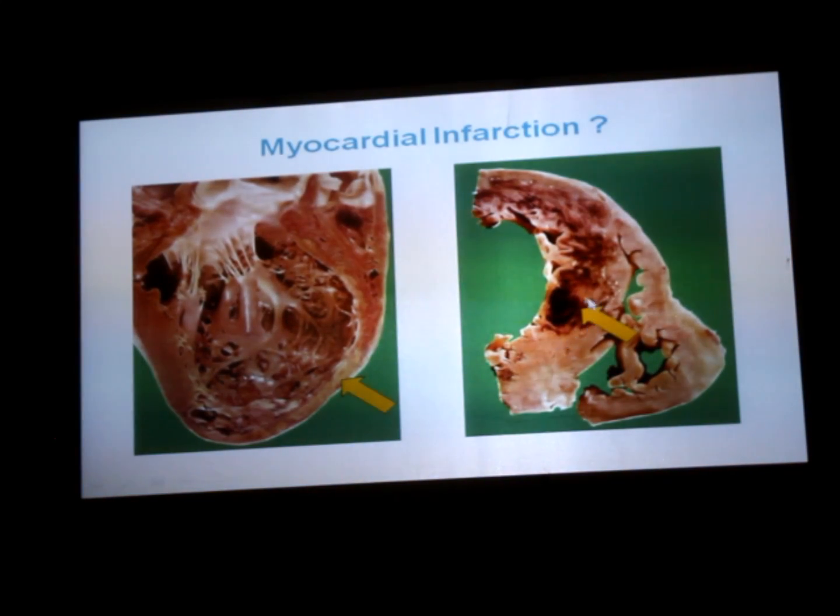Now when no blood supply was there, the cells in this area died. Okay, and this showed necrosis. So this localized area of necrosis in a solid organ like the heart, because of obstruction to blood flow, is an infarct. Okay, so you can see this is also an infarct, this is also an infarct.